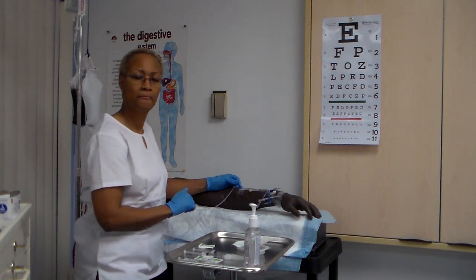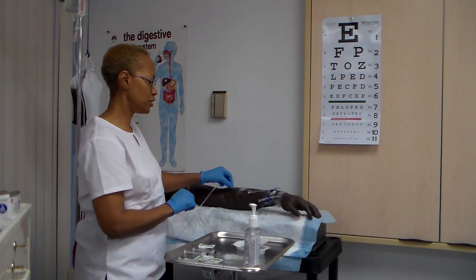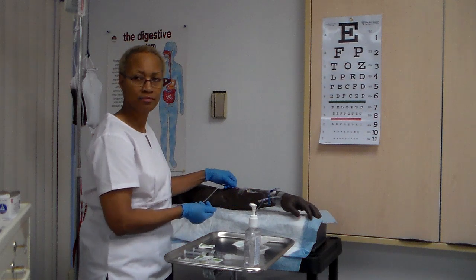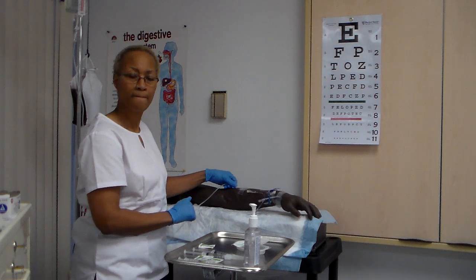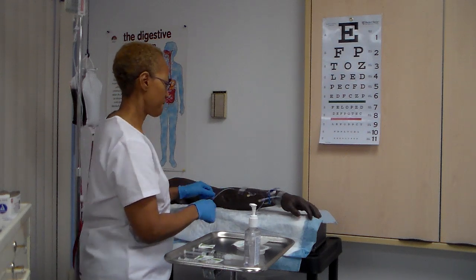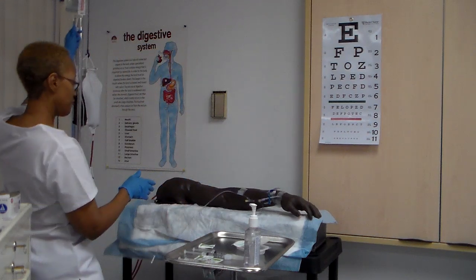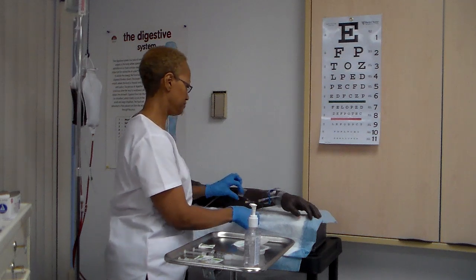Okay. Allow IV fluids to infuse when not pushing medication. So in between your pushing, you're going to unpinch it and let your IV fluid run. After injecting medication, release tubing, withdraw syringe, and recheck fluid infusion rate. So I check again, make sure everything's infusing, everything is fine. Okay.